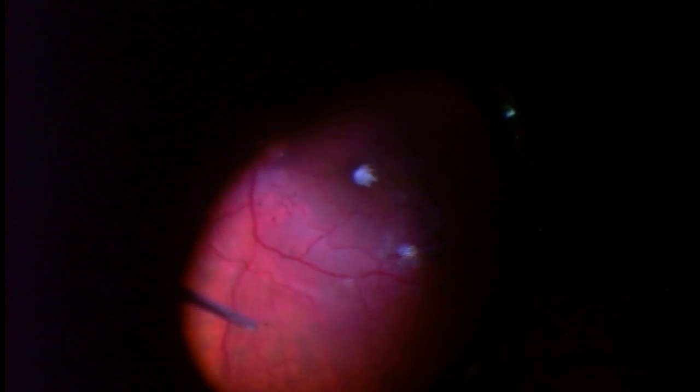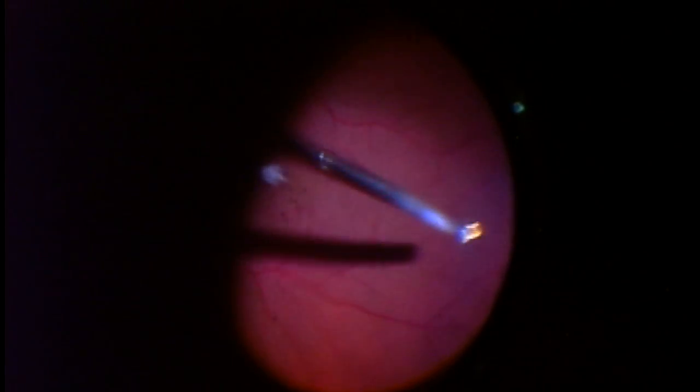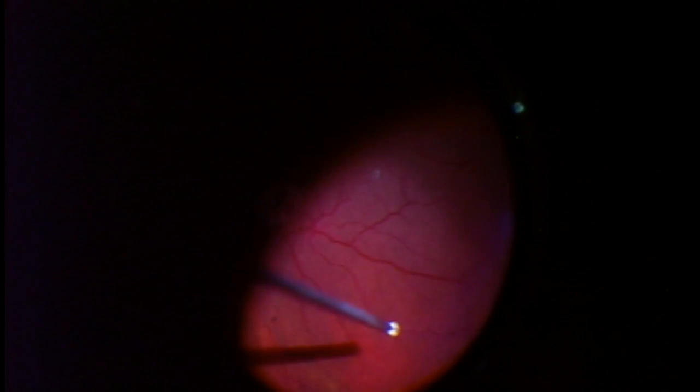Whatever Kenalog or steroid that I don't remove actively during the operation will be dissolved and absorbed over the next day or so. So now I'm going to go around to the side or anterior vitreous to remove as much as I can, and then just at the end of the operation, I'm going to get that little nubbin of Kenalog which is left sitting on the macula.